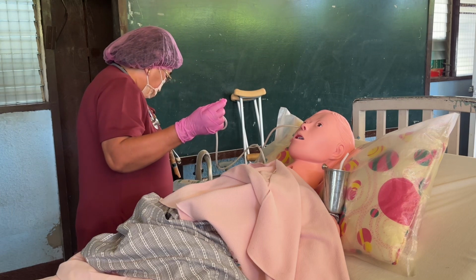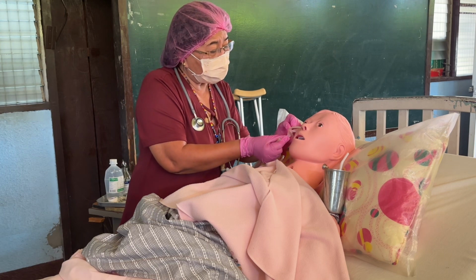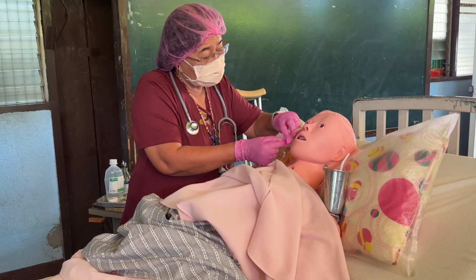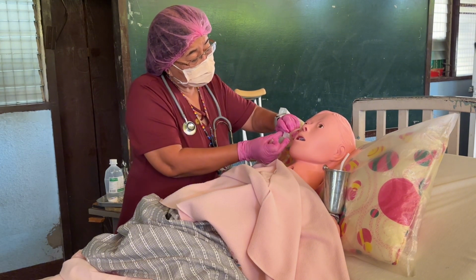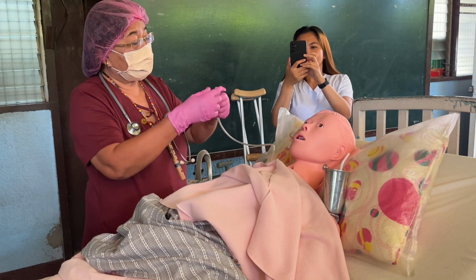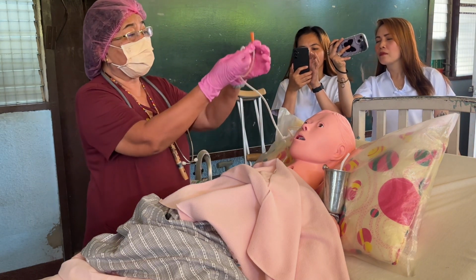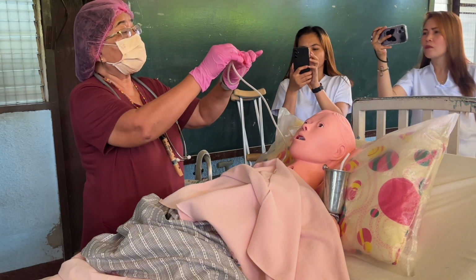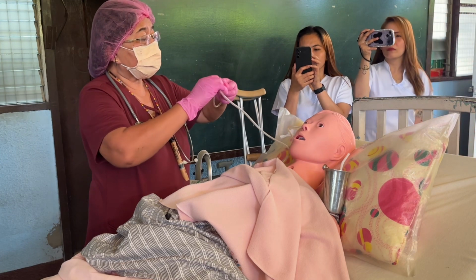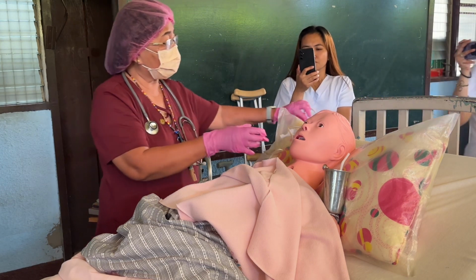Then, temporarily anchor to avoid moving. Okay, that's only temporary, no? Okay, it's kinked. And then, there are tubes that really have a lock. This one has no lock, so improvise. I bent it, then I inserted it in the opening of the tube. There, so it's already locked. So lock it well. So there are gastric juices that come out from the tube already.